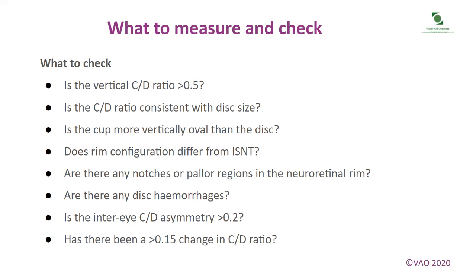Is the inter-eye cup to disc asymmetry greater than 0.2? Or has there been a greater than 0.15 change in the cup to disc ratio since this patient last has been examined?